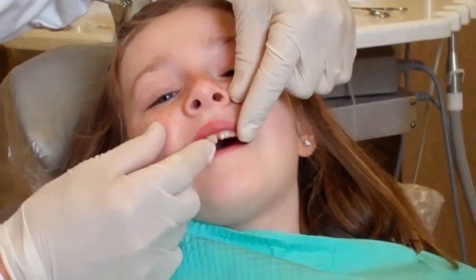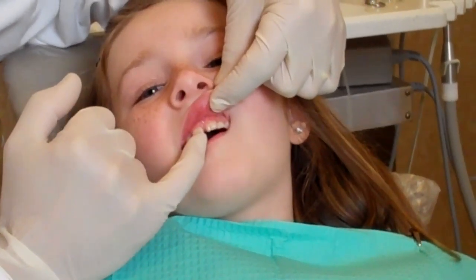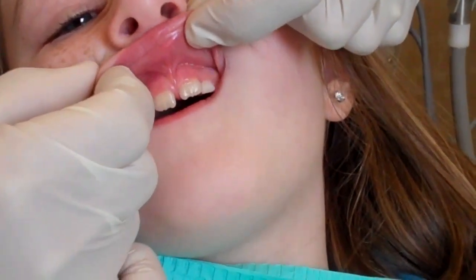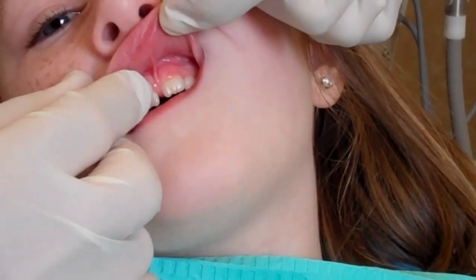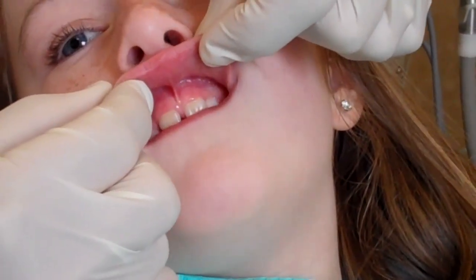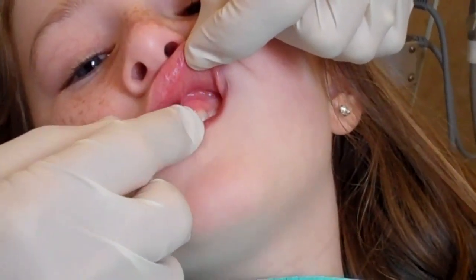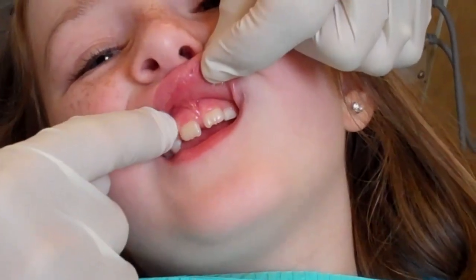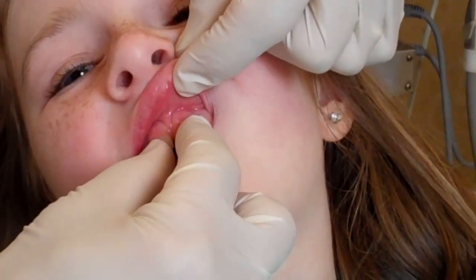For Hannah, we're going to show you what it actually is. As we can see, her adult teeth are starting to come in and you can see that they're spread — there's a big space between them. There's this muscle fiber right here, this attachment that connects the top lip to this area, and sometimes they're too large. Once we remove this muscle attachment, she'll have room for these teeth next to them to come in.